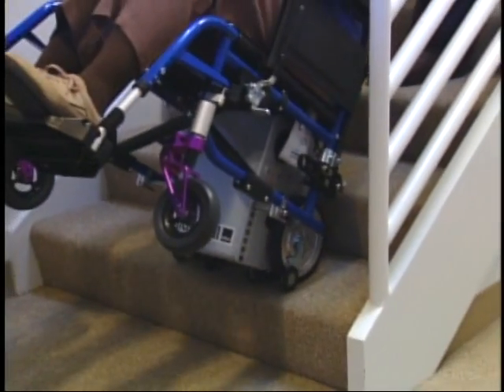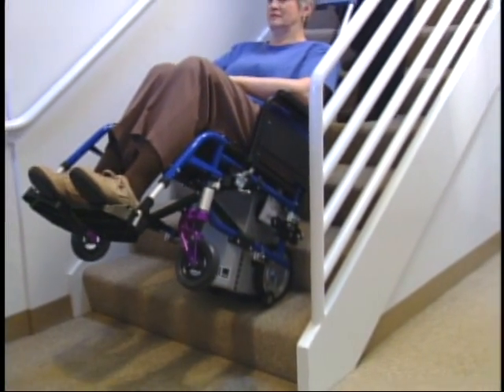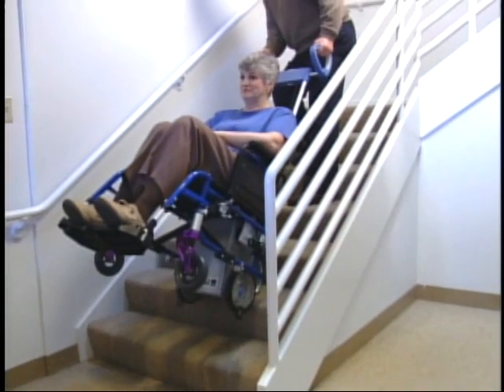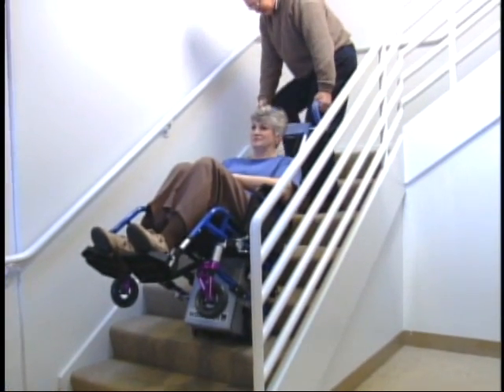For a wheelchair user, stairs can be a major obstacle, and they are everywhere — at home, at work, and in between. With Scattermobile, you can easily surmount these obstacles.